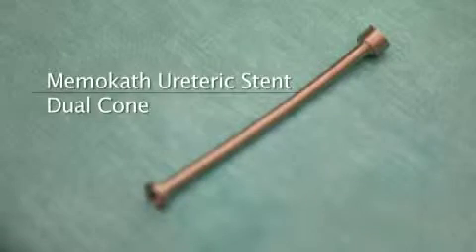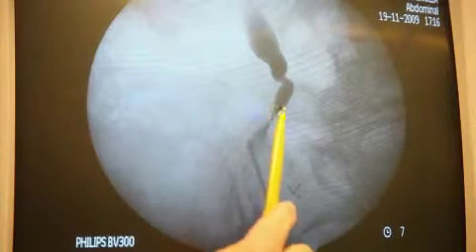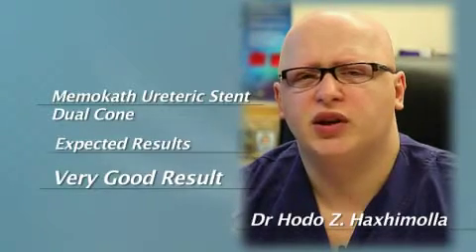The Memokath dual cone is going to be used today to treat obstruction in this kidney and also to try and save the kidney in the longer term. The obstruction is in the upper mid-ureter, and this is very difficult to try and repair for her with the normal means. The expected result in this lady is going to be very good.